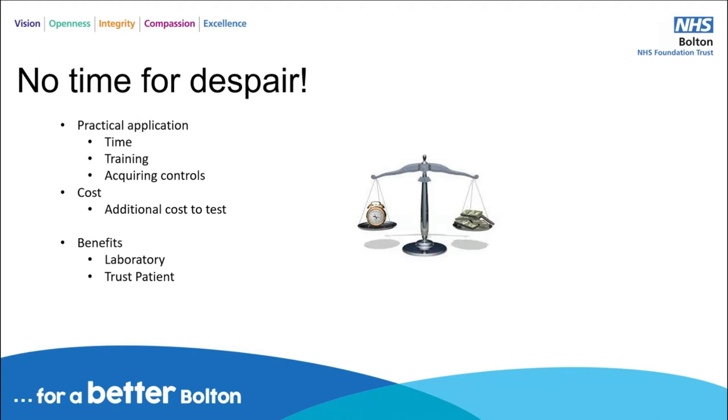The grey area is very close to the cutoffs. If you look at in-house first-party controls, very often the positive control is very, very high. That's always going to give you a positive, and the negative is very negative. There's nothing in that in-between area. So a lot of time and a lot of training was going to be needed around revalidating and re-verifying a lot of processes and analyzers that we already had in place. So it was going to be very time-consuming.